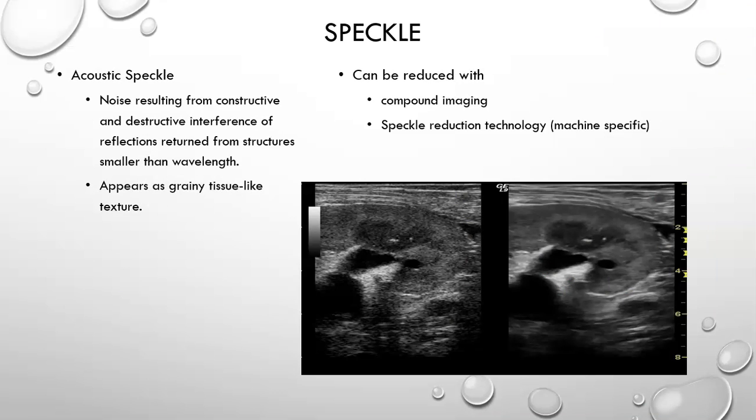Recently on the SPI examinations, they've started asking questions on what speckle is. Acoustic speckle, which we've often seen on ultrasound since the beginning of time, just makes our tissues look very grainy. But it turns out that tissues don't have to be speckly, even ultrasound tissue.